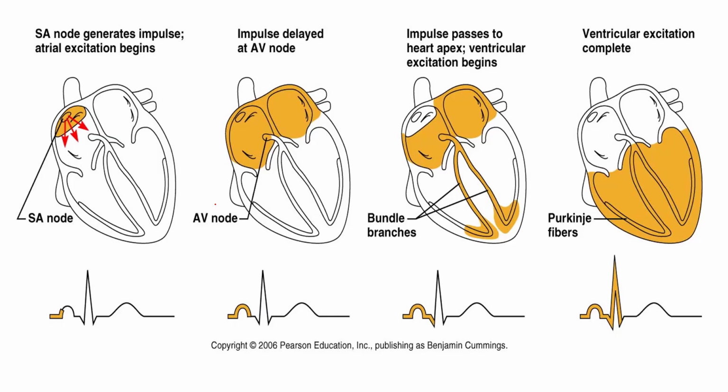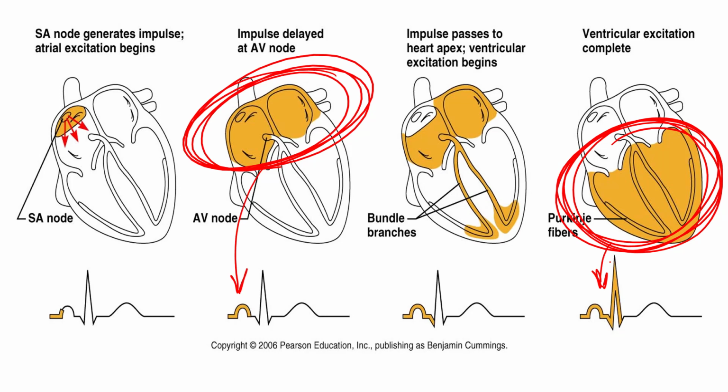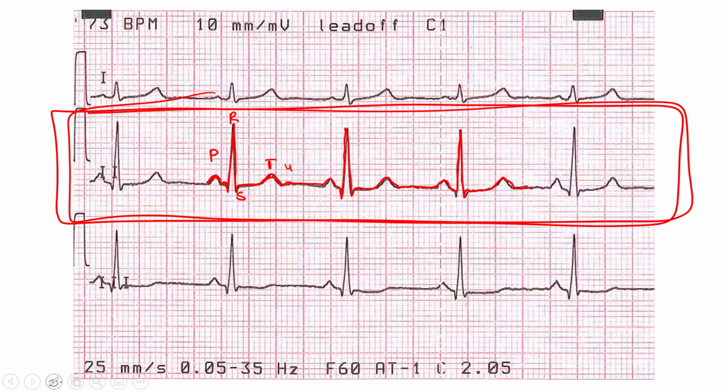One thing to remember is that the electrocardiogram only represents electrical activity. No valves, no contractions, only electrical activity. The P wave is dependent on the atrial cells or atrial myocytes. When they depolarize, it causes the P wave. When the ventricular myocytes change their charge from negative to positive, that represents the QRS, ventricular depolarization. When those cells reset their charge on the inside back to negative, you get repolarization, and that represents the T wave. T wave represents ventricular repolarization. So keep that in mind, only electrical activity on the ECG.